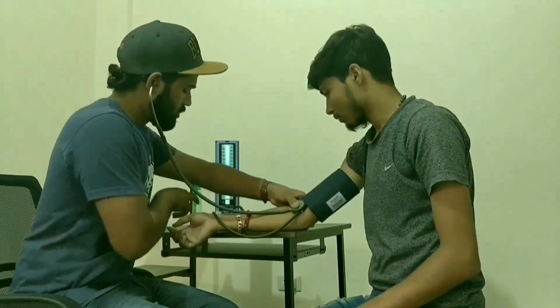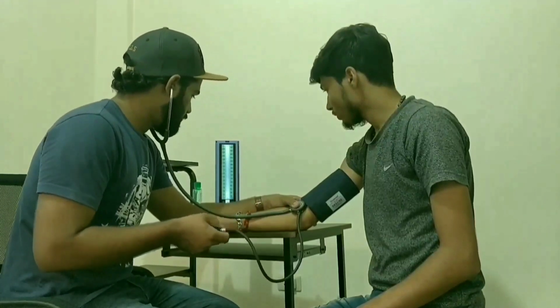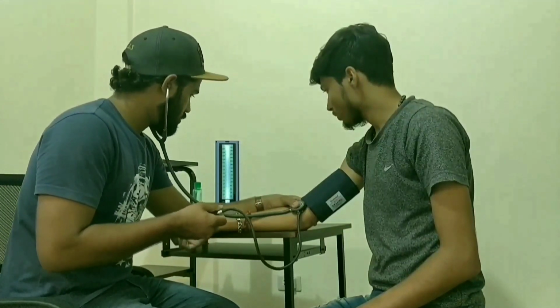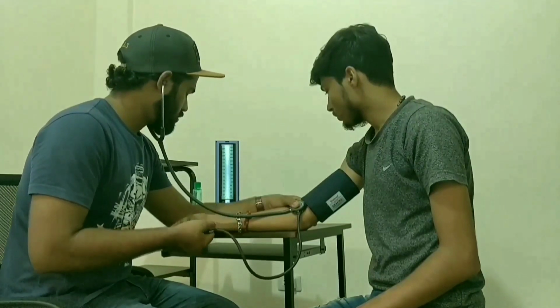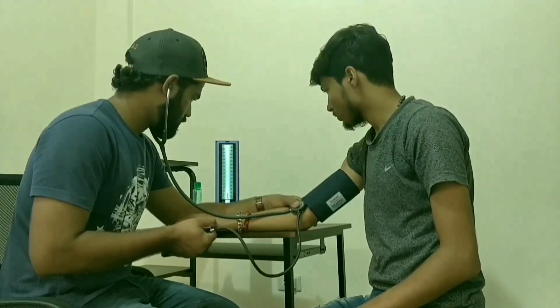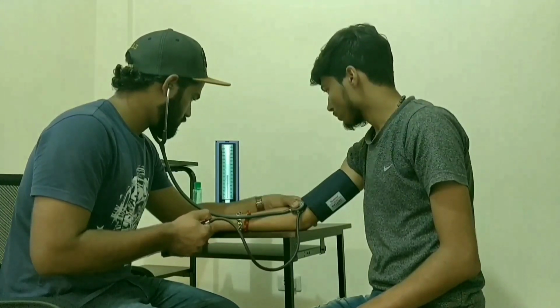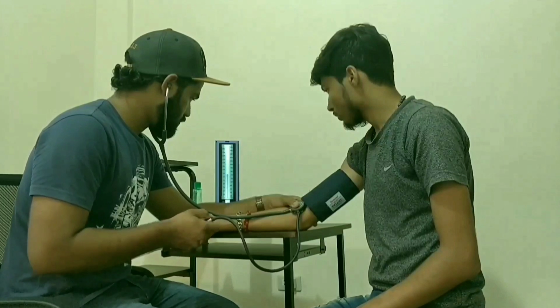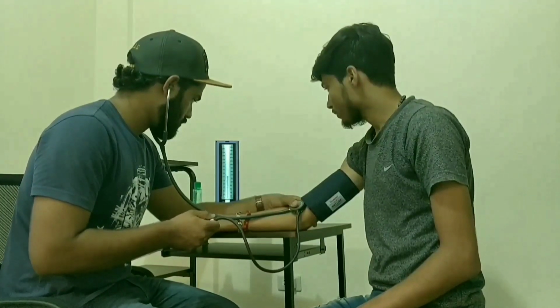And after waiting for 15 to 30 seconds, you will again inflate the cuff to the reading which you have noted before, and you will add 30 more to that reading because you don't want to discomfort the patient with high pressure. And this also avoids the auscultatory gap, which is the silent interval between systolic and diastolic pressure.